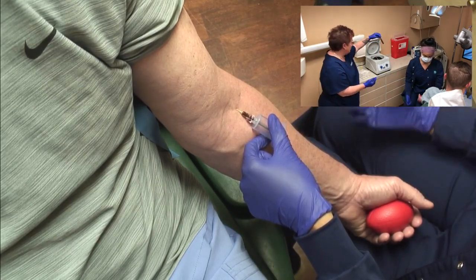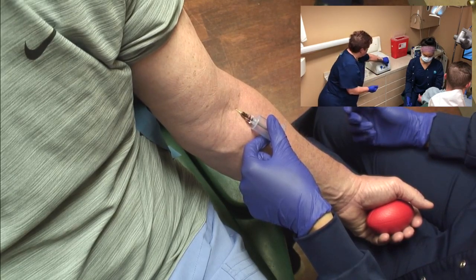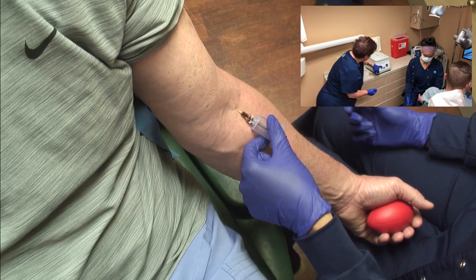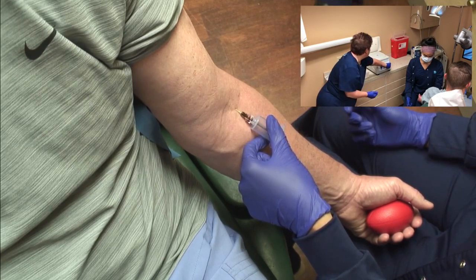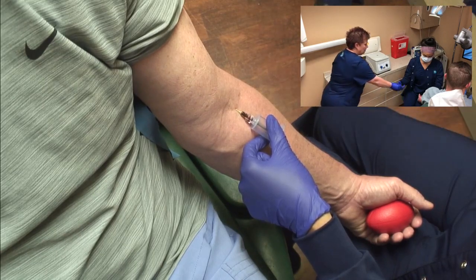So I have two of these now. This is going to be balanced, so we're going to start this right away. This is set on 2.5. We're going to go 15 minutes, and that's going to start spinning. Now I'm going to hand China the yellow tube.